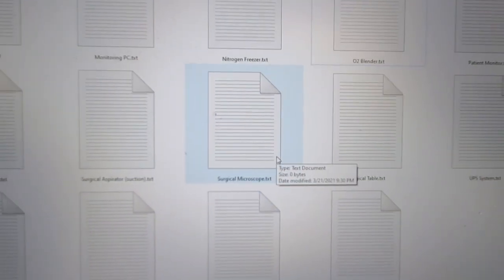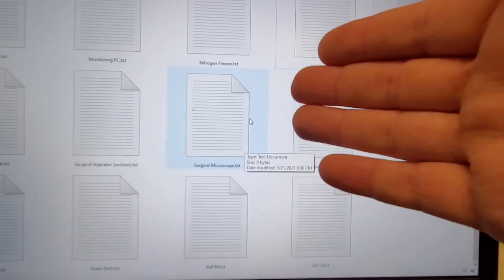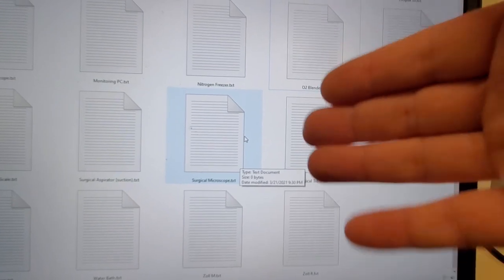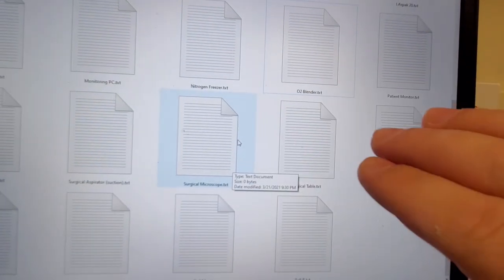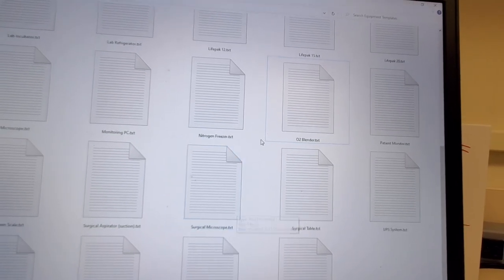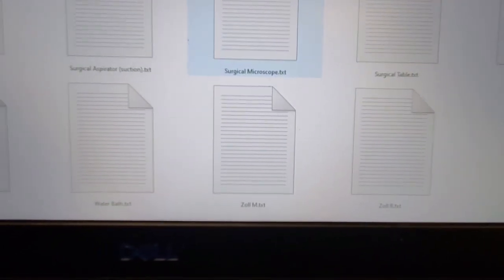But all the rest of this stuff, like surgical microscope — there are going to be some specific notes whether it's a Leica or a Zeiss, but not too much. It does matter for your others, like your LifePaks, your defibrillators. Those ones are going to be very specific because your LifePak 12 is going to have different tests than your LifePak 20, your Zolls. I do believe I have Zolls on here — yeah, I do. Zoll M, Zoll R's.